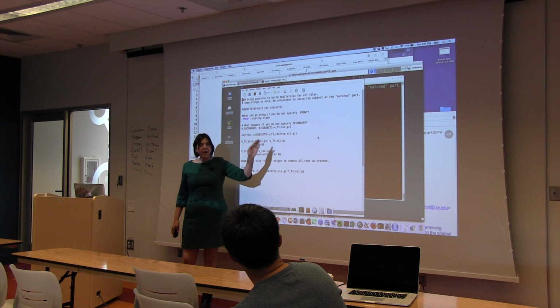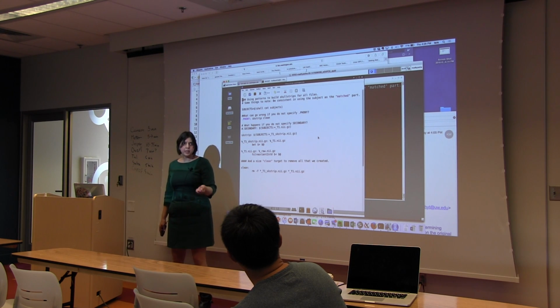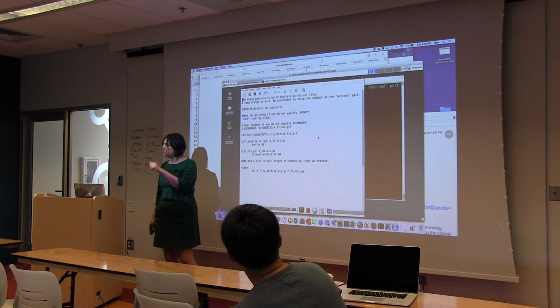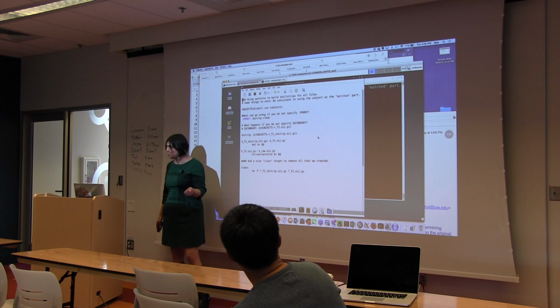There are many ways you can get a list of subjects. If you feel like using patterns, you can use the patterns in the names, and you can extract that. You can dynamically pick up whatever. You can refer to another directory and get the names from there, whatever happens to be there. That's nice, for example, when somebody puts a new T1 image in a new directory and you want to do all the processing for that person, you can refer there and automatically pick up new subjects.